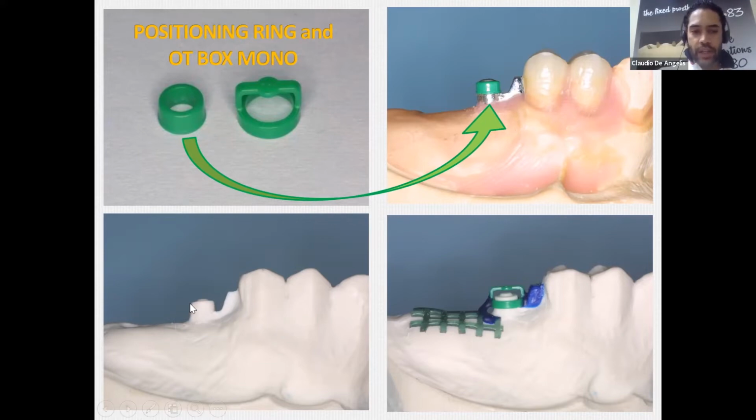After that, you can see we just duplicate the ring, not the sphere, and mostly not the retentive cap. This is another huge mistake dental technicians too often do. They put the retentive cap over the sphere and they duplicate it. The second biggest mistake of their life.